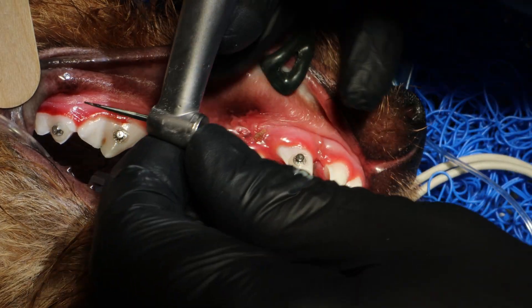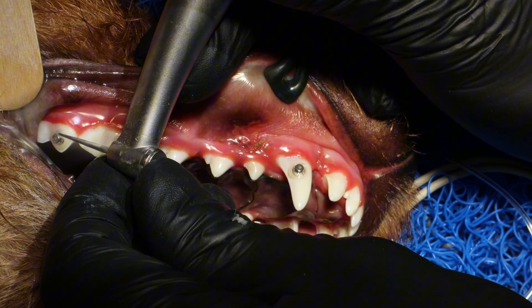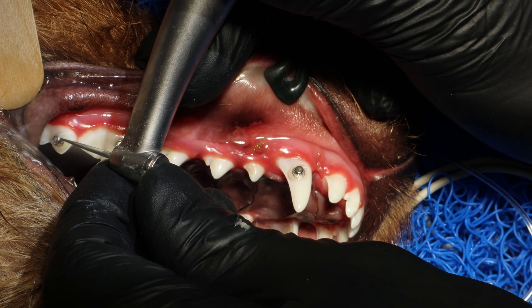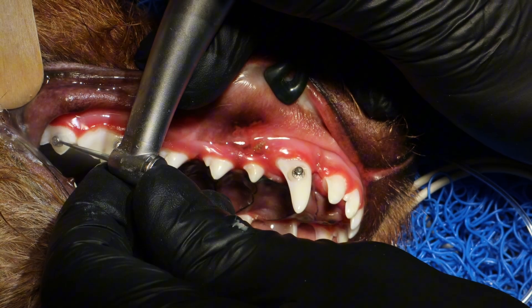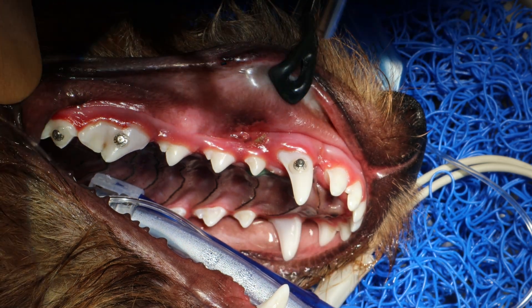I just noticed on the first button that there was a little composite sticking up so we couldn't put the elastic chain on. So I'm using just a small root tip burr to drill that away.